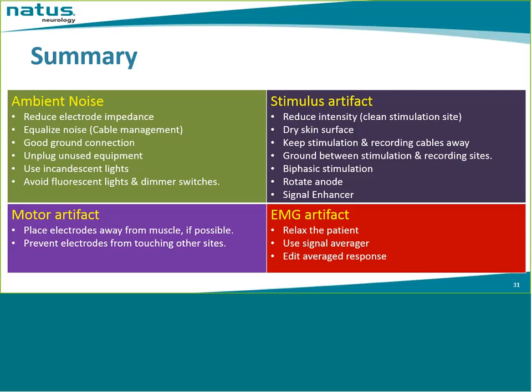This looks like a very long list of things to do. But once you start using these techniques, it will become second nature. You always will automatically clean the skin surface. You will apply the gel, secure the electrode. You will always use a good technique for stimulation and so forth. So it becomes second nature. And then you will find that the sensory nerve conduction studies technically become less demanding, and you will be more confident, more happy with the responses that you get for your electrodiagnostic assessment.